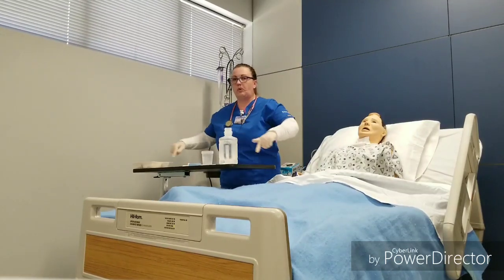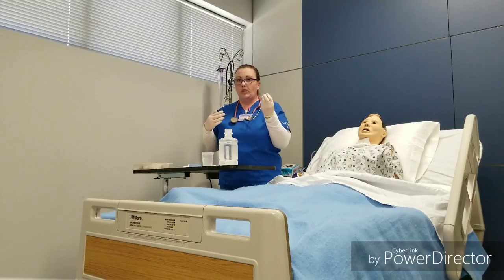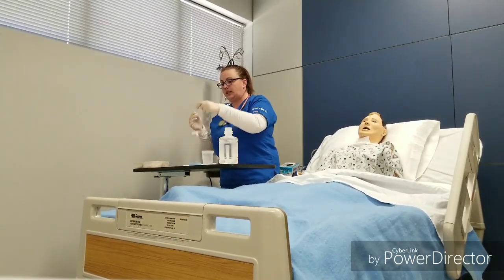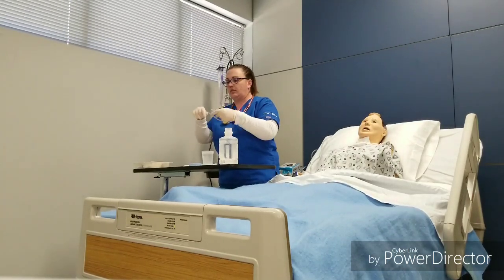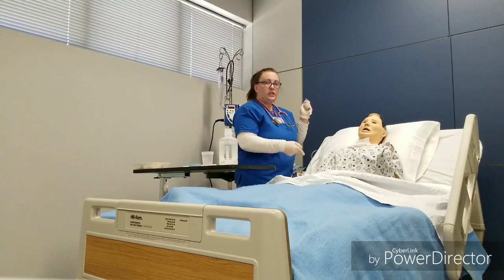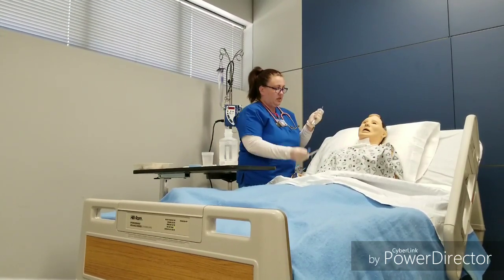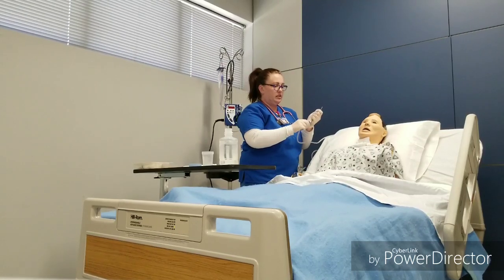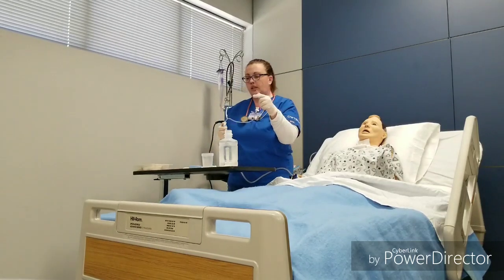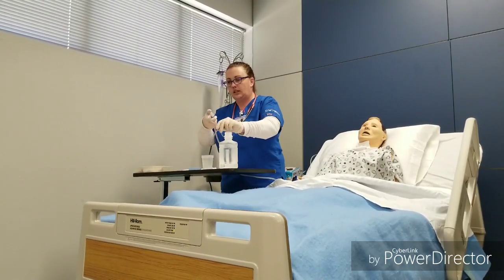Sterile field, remember, 1 inch border around everything. You're going to have 1 sterile hand, 1 clean hand. Your sterile hand, you're going to wrap it around. Everything's sterile. Once you touch this tubing down here, you are no longer sterile. Attach it. Tubing where you need it.